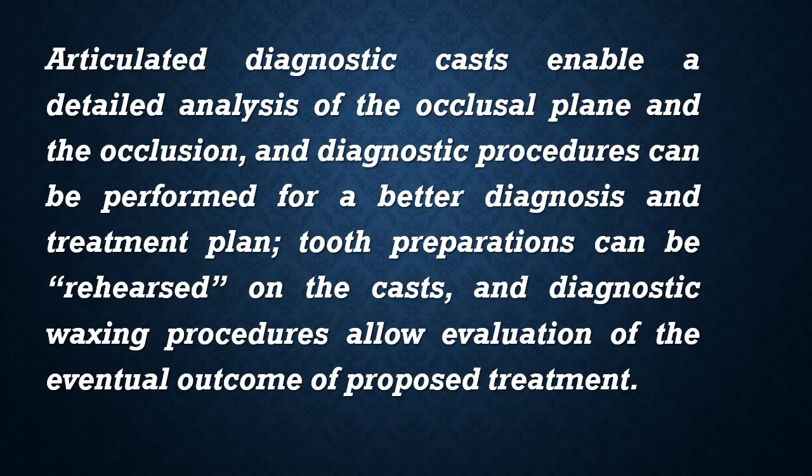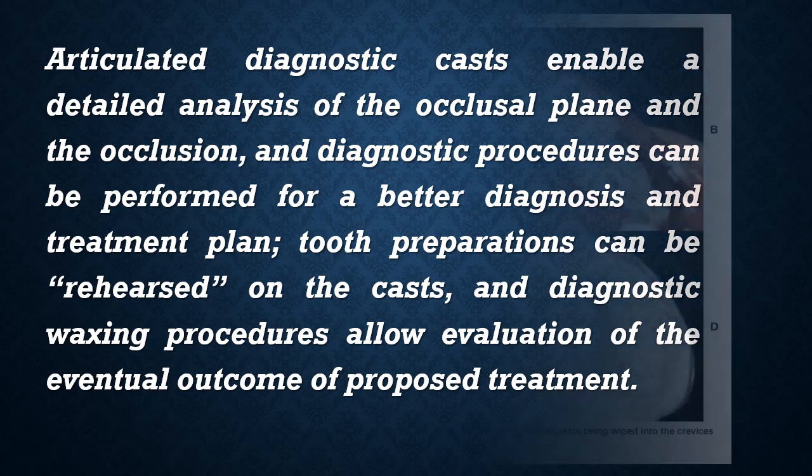The main advantage of articulated casts is that it will enable you to have a good analysis of the occlusal plane and the occlusion, and diagnostic procedures can be performed for a better diagnosis and treatment plan. Also, it allows you to rehearse tooth preparation on the cast, and diagnostic waxing allows evaluation of the eventual outcome of the proposed treatment, and it is also used for occlusal analysis.